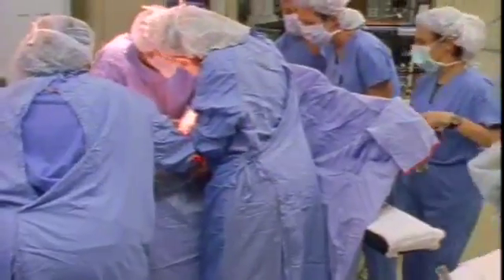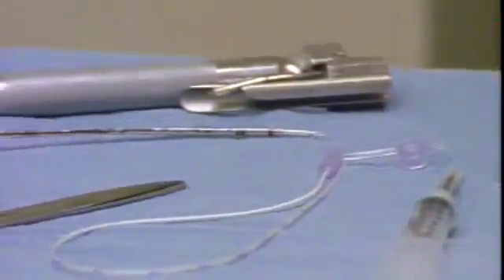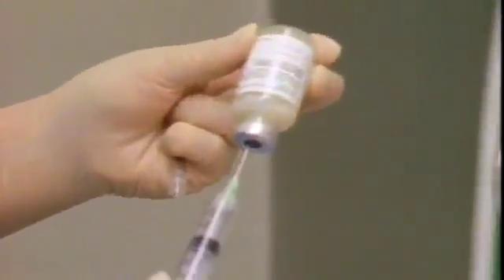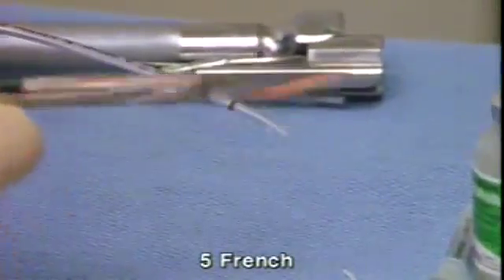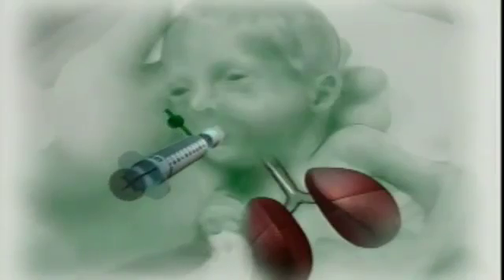Use gestational age to anticipate infant size and the need for surfactant. Have ready a room temperature vial of Surfactant, a syringe, 5 French end-hole feeding catheter, and a sterile cutting tool. Draw Surfactant into the syringe through a large gauge needle. Cut the 5 French catheter long enough so that it will pass through the ET tube with the distal end just above the carina.